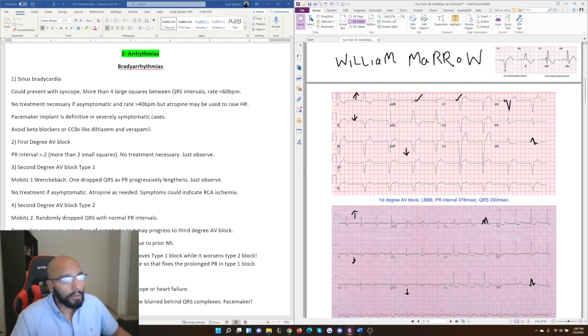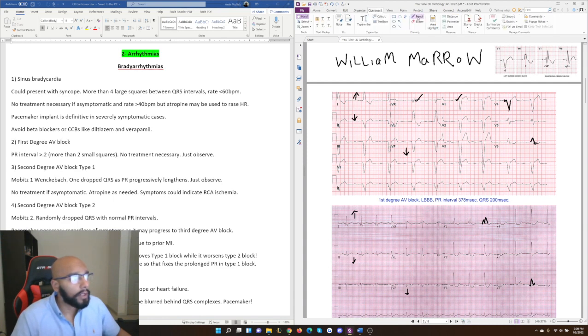Okay. In this patient here, when you look at it at first glance, it obviously definitely does not look very normal. And as we further examine it, we start seeing some features that don't match some of the normal things we talked about in our last video. So for example, let me grab my pencil. So we know that aVR and V1 are supposed to point down, and that's good. So I put check marks there.